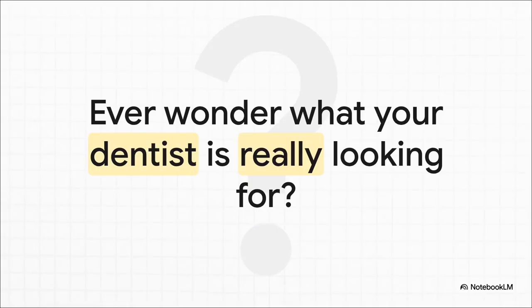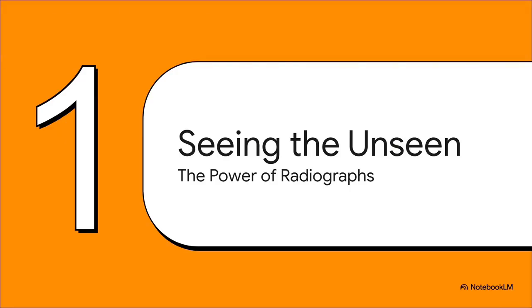I mean, think about it. Your dentist can look at your teeth, sure, but they can only see the surface. The real story, a lot of the time, is happening underneath the gums, inside the tooth itself. So this whole technology was basically invented to answer one huge question: what are we missing? And that brings us right to the core power of the X-ray, the incredible ability to see the unseen.